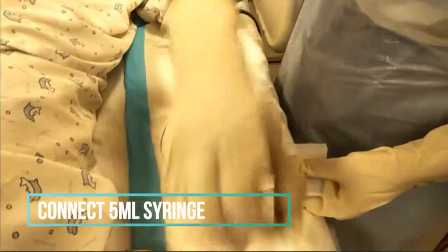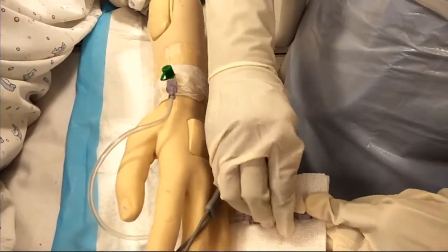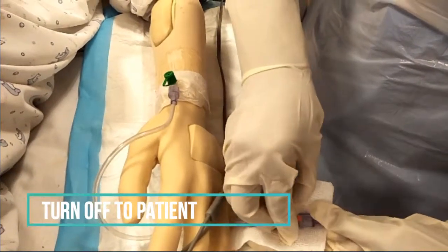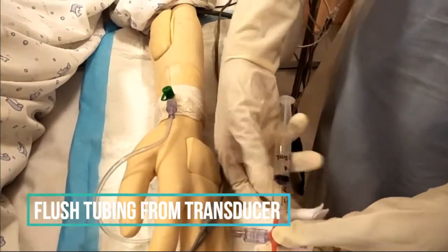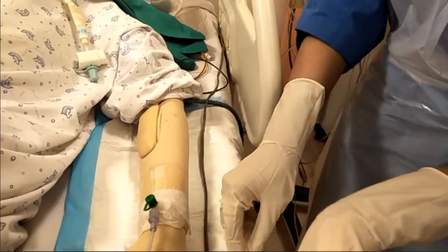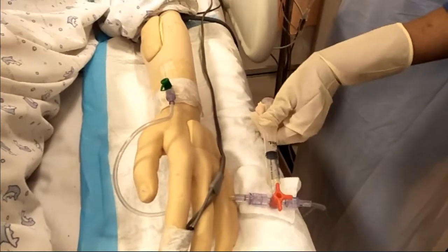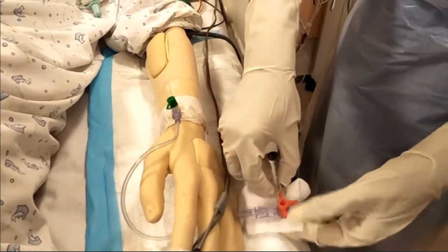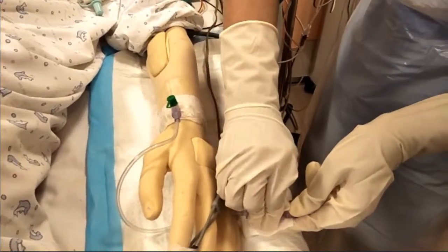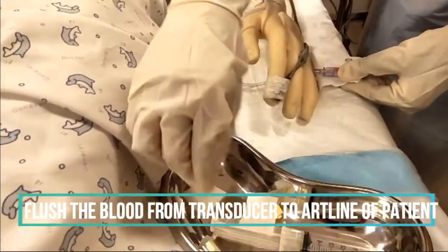Next, connect 5 ml syringe to flush. Turn on the stopcock. Then flush the tubing from the transducer. Next, put on the stopper. Flush the blood from transducer to the arterial line.